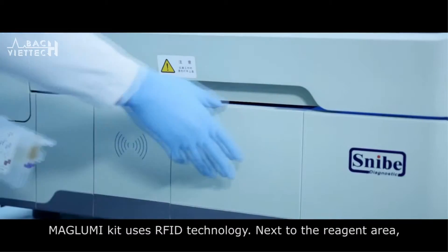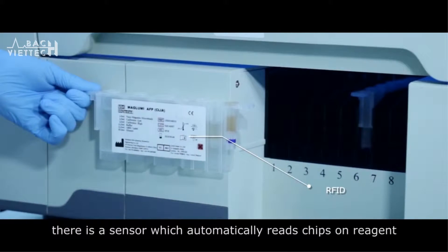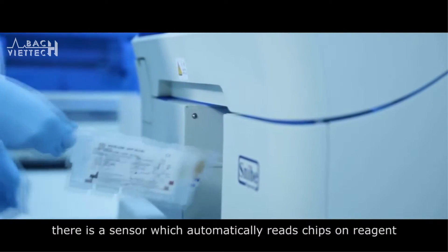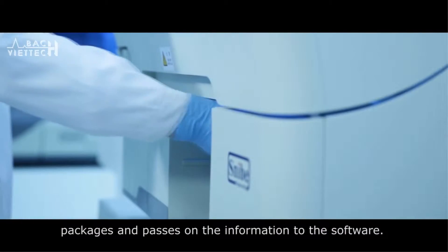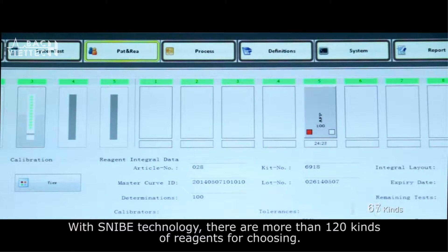The MAGLUMI kit uses RFID technology. Next to the reagent area, there is a sensor which automatically reads chips on reagent packages and passes all the information to the software. With Snibe technology, there are more than 120 kinds of reagents to choose from.